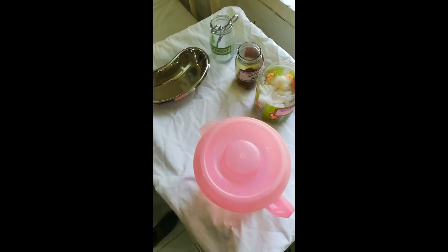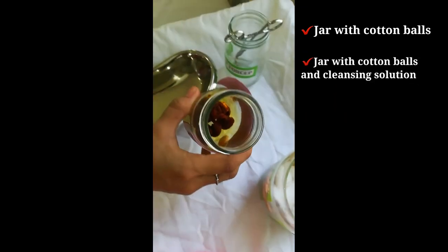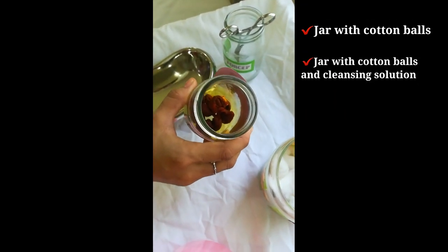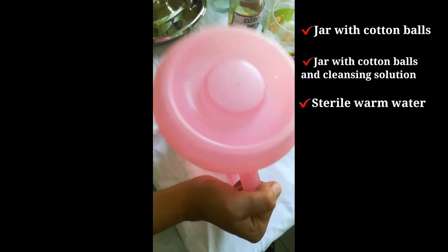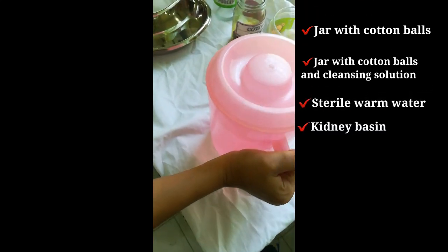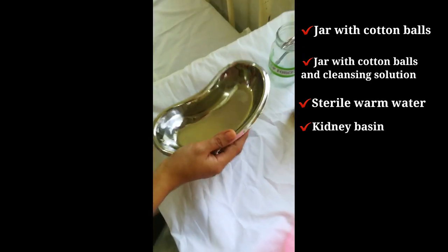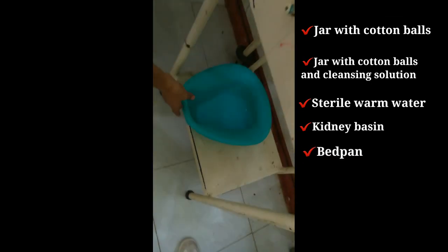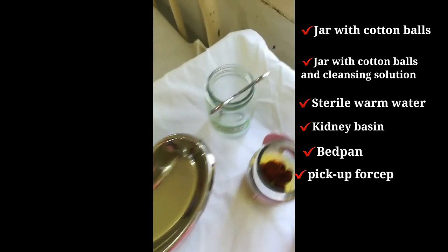What are the equipments that we need? We have a jar with cotton balls and cleansing solution — usually it's a betadine solution. A pitcher with sterile warm water, kidney basin — this is used for soiled cotton balls — and then the bedpan, and the forceps, or pick-up forceps.